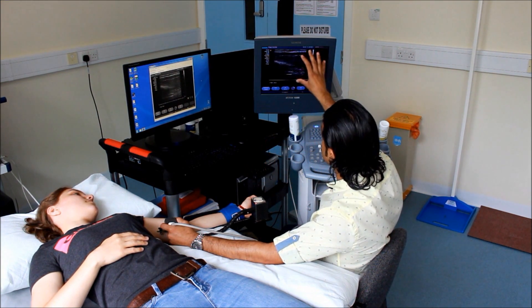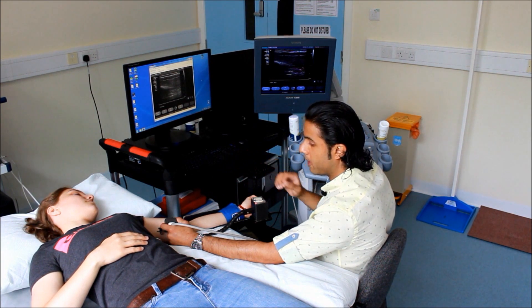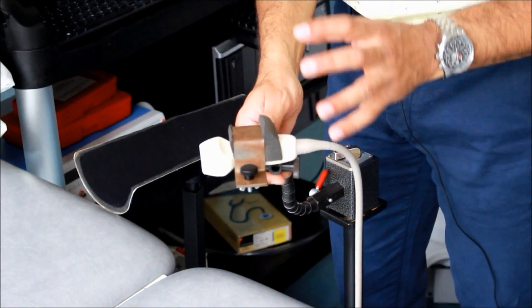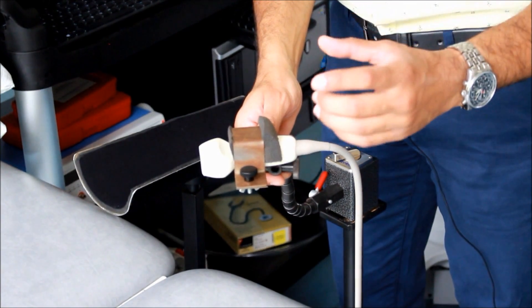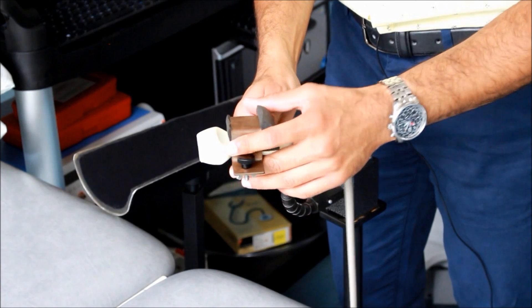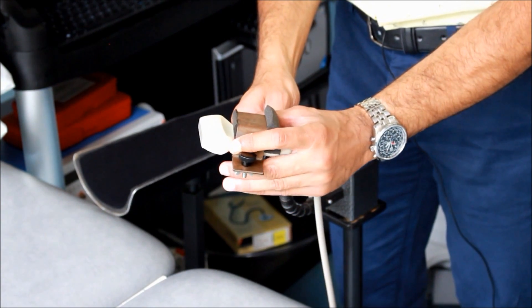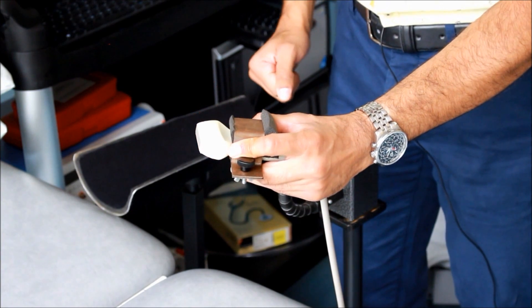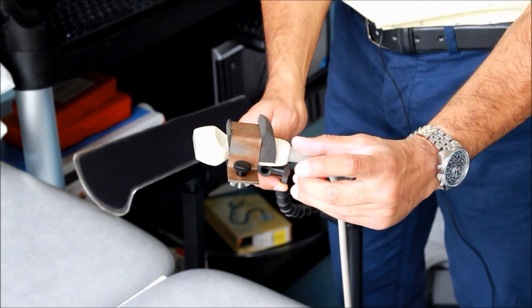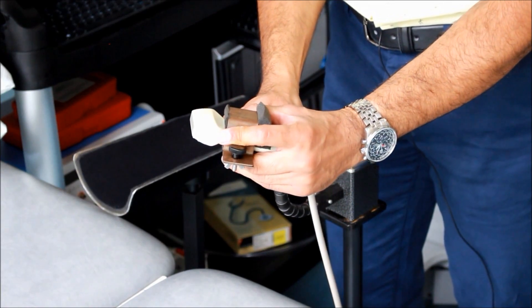The main thing is that the ultrasound settings are optimized, that your scanning is consistent, and you go through all of the steps in a systematic manner. Hopefully you'll then be able to perform the flow mediated dilatation test successfully. A final thought: when holding the ultrasound probe, it's very important to keep your hands and fingers in a particular position. The best way to get a stable image is to have your index finger just across here, your thumb on the other side of the probe holder, and then these three fingers literally just underneath the probe to support it. So index finger on the left side, thumb on the right side, and the three fingers curled up together to hold and steady the probe.